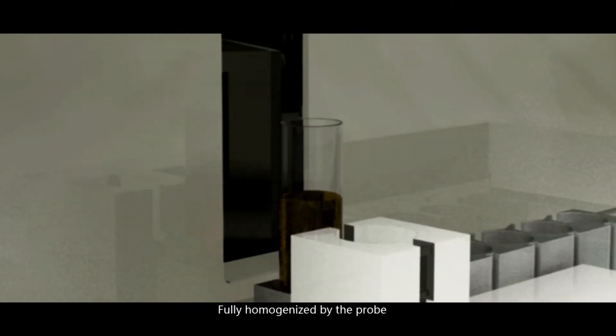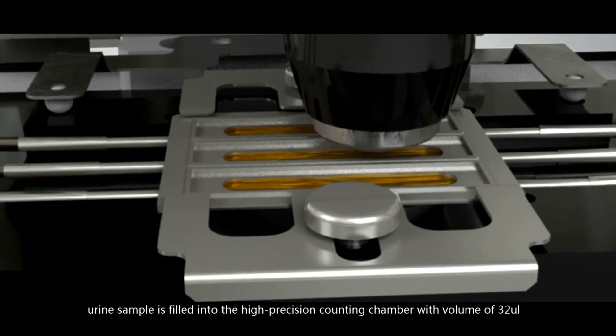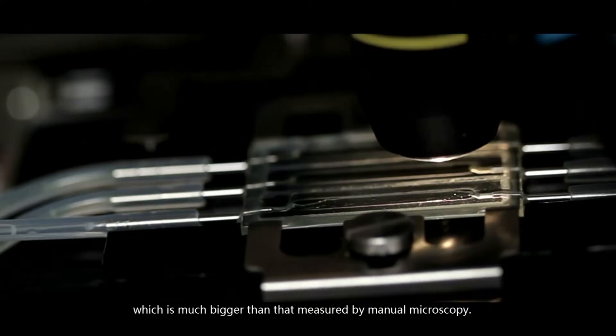Fully homogenized by the probe, urine sample is filled into the high-precision counting chamber with volume of 32 microliters, which is much bigger than that measured by manual microscopy.